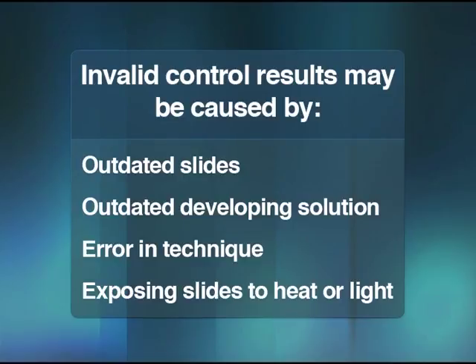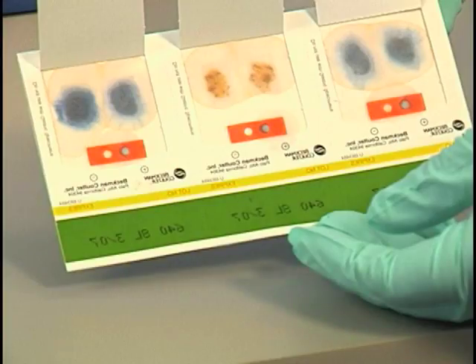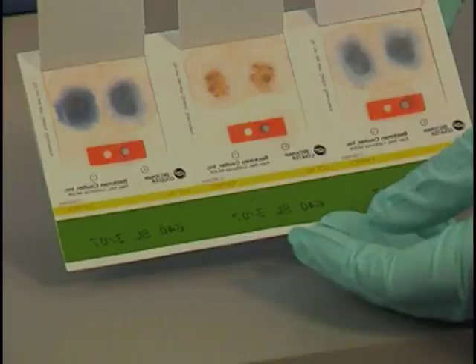This may be due to outdated slides or developing solution, an error in technique, and subjecting the slides to heat, sunlight, or strong fluorescent light. As you can see, the quality control results on this test reacted as expected.